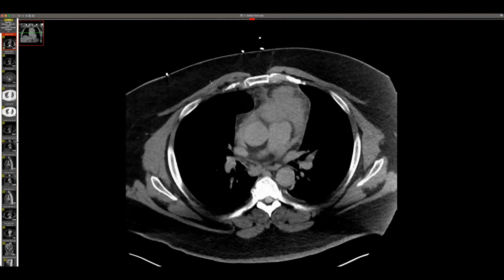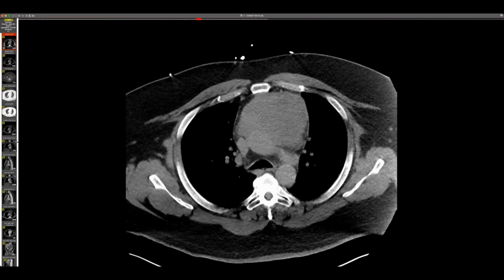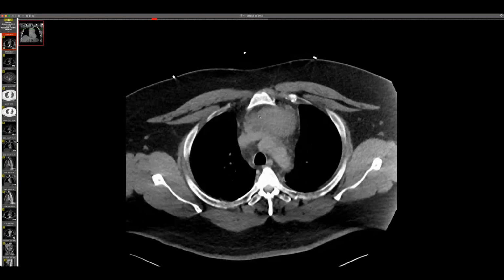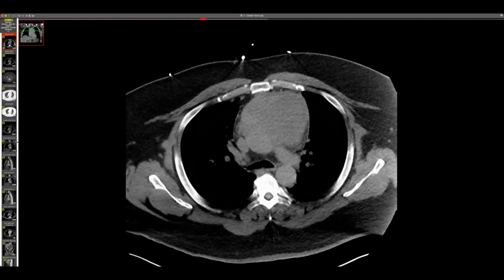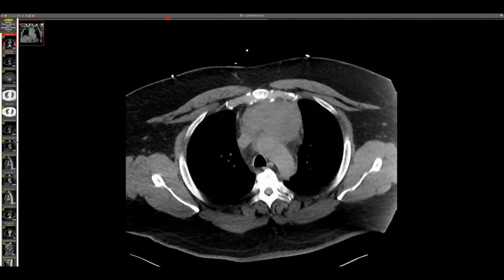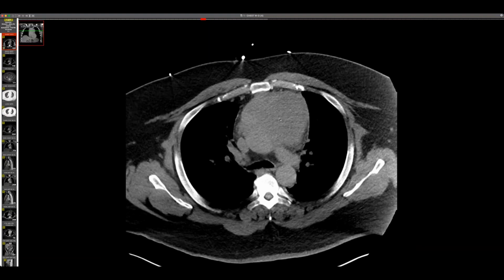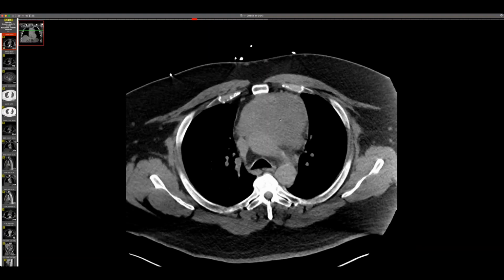Fairly soft. I think I would put thymoma as the first consideration here, ahead of germ cell tumor, and it doesn't continue into the neck and stuff like that. This was biopsied. We're awaiting the pathology on the resected specimen, which was just handled last week. And this is a thymic carcinoid. I can't remember the last time I saw a thymic carcinoid tumor, so I think they must be fairly uncommon.